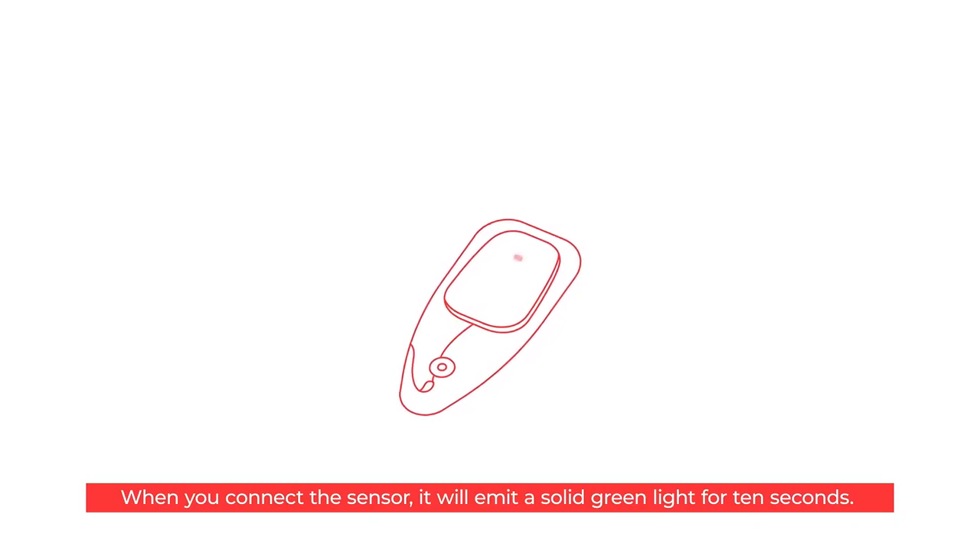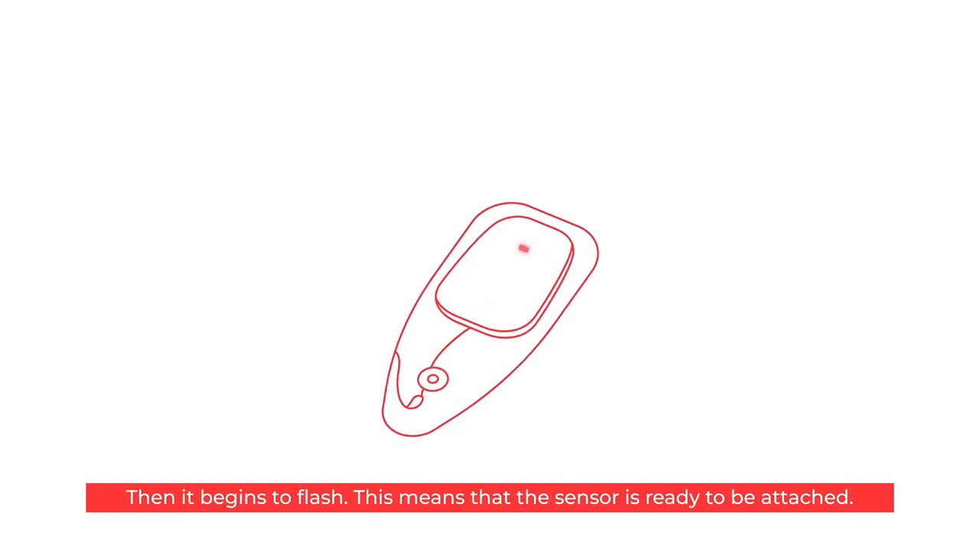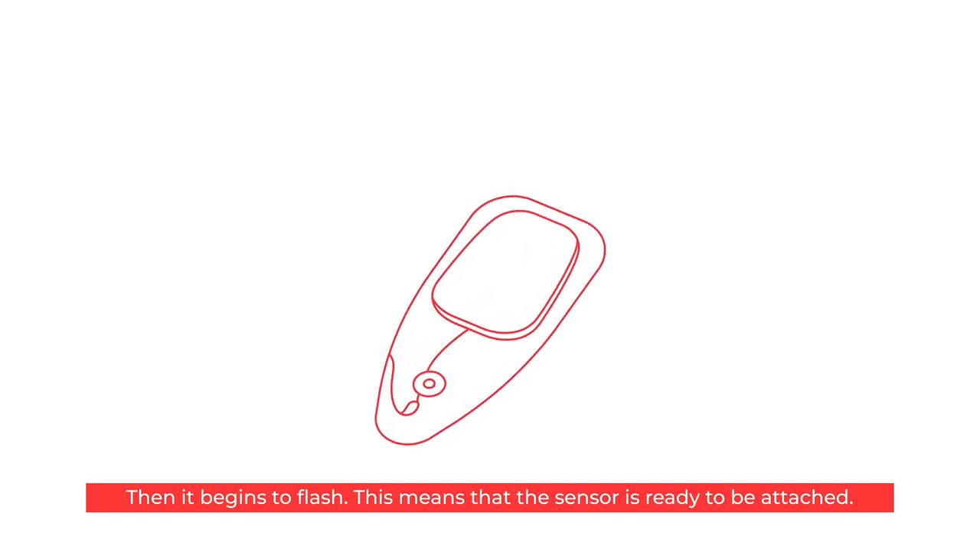When you connect the sensor it will emit a solid green light for 10 seconds. Then it begins to flash. This means that the sensor is ready to be attached.